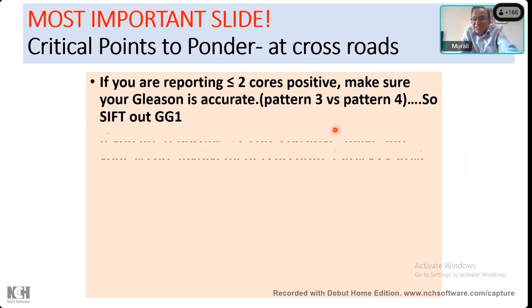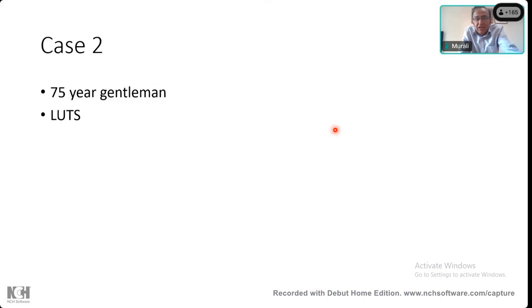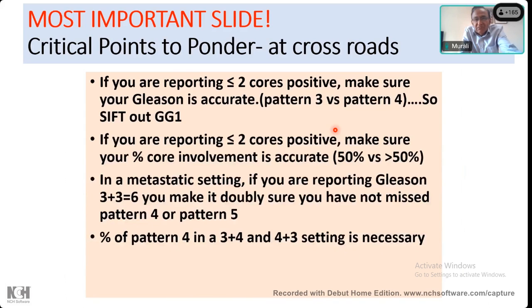Can I ask a question to the students? How many of you do breast biopsies? Do you measure the tumor in breast biopsies? No. You don't measure the length of tumor in breast cancer. You don't measure the length of tumor in any other cancer in a biopsy. If you get a thyroid cancer biopsy, a papillary carcinoma, you don't measure the length, right? So why do you measure the extent of tumor in prostate when you don't do it in any other organ?